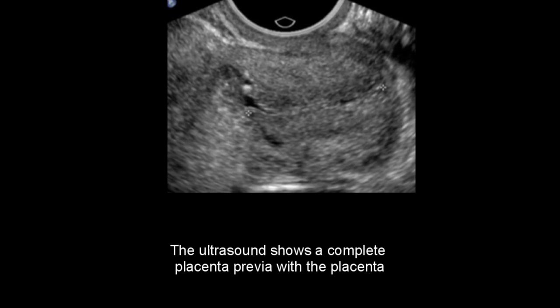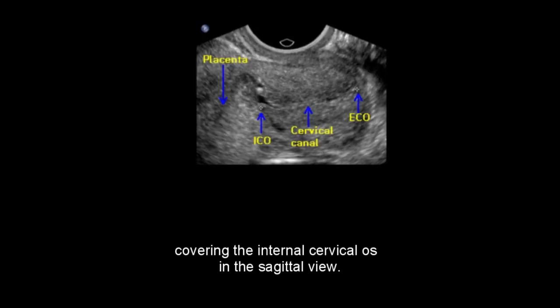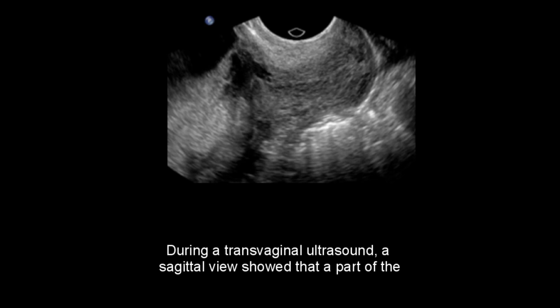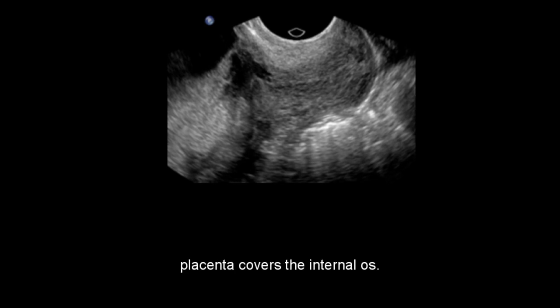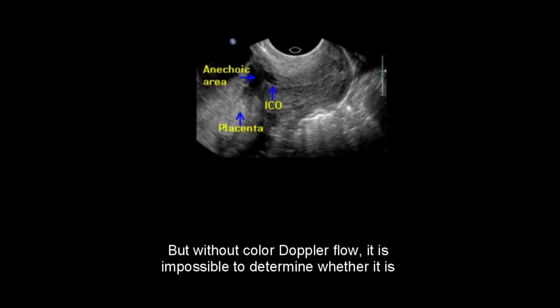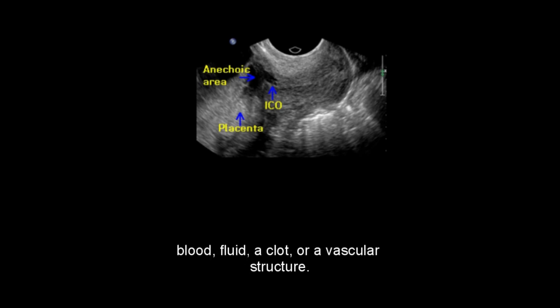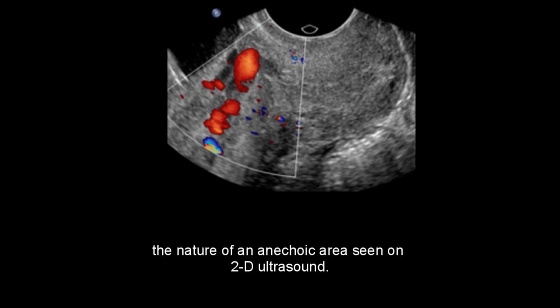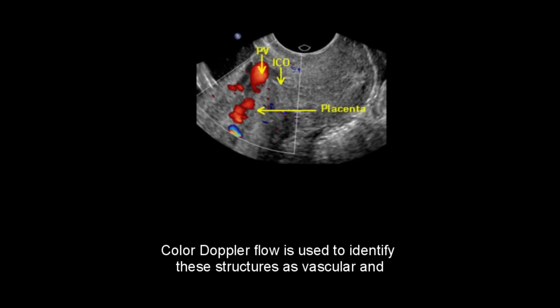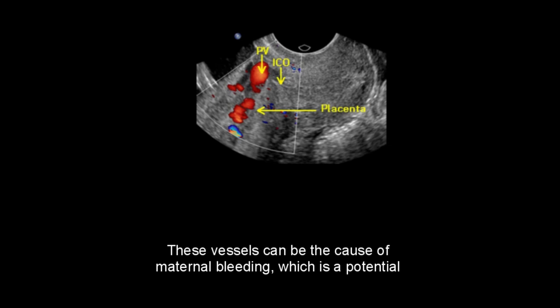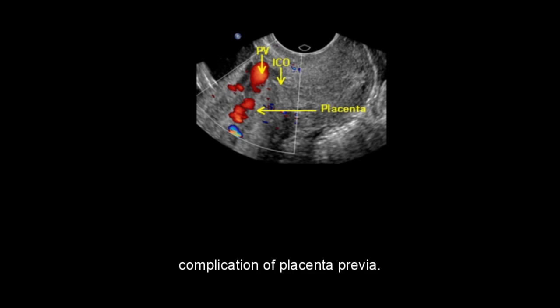The ultrasound shows a complete placenta previa with the placenta covering the internal cervical os in the sagittal view. During a transvaginal ultrasound, a sagittal view showed that a part of the placenta covers the internal os. There is also an anechoic area near this region, but without color Doppler flow it is impossible to determine whether it is blood, fluid, a clot, or a vascular structure. Color Doppler flow is then used to identify these structures as vascular, representing placental vessels, which can be the cause of maternal bleeding — a potential complication of placenta previa.